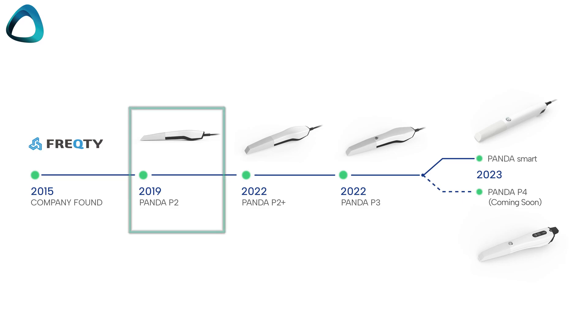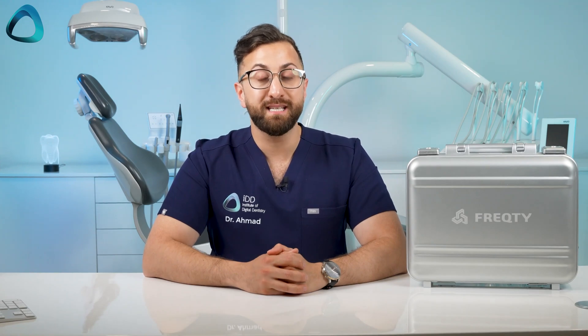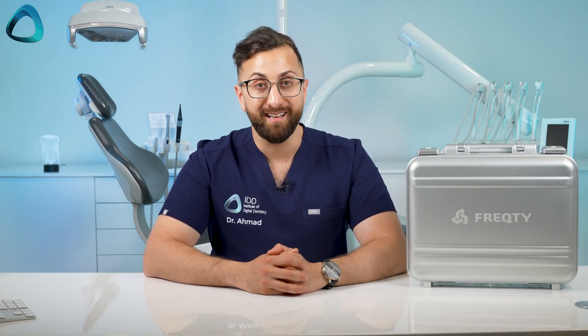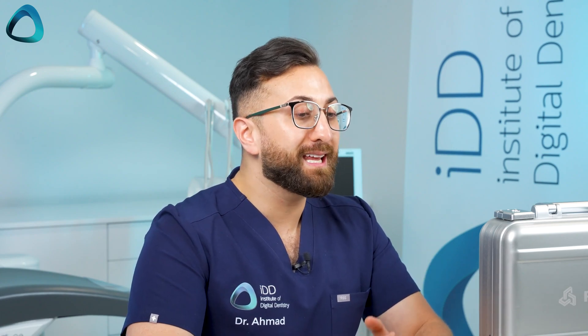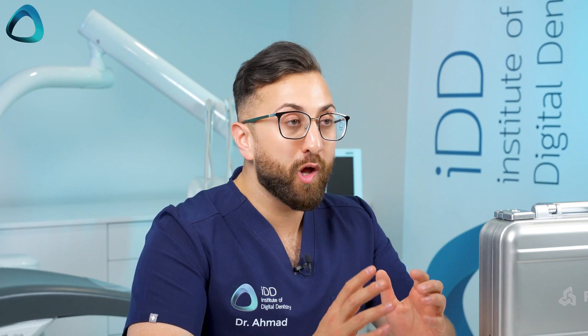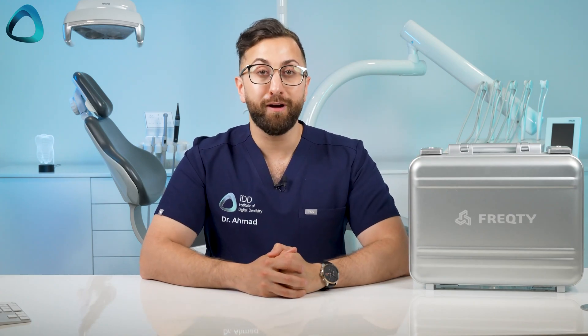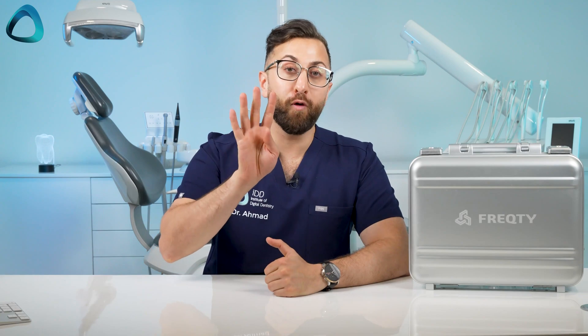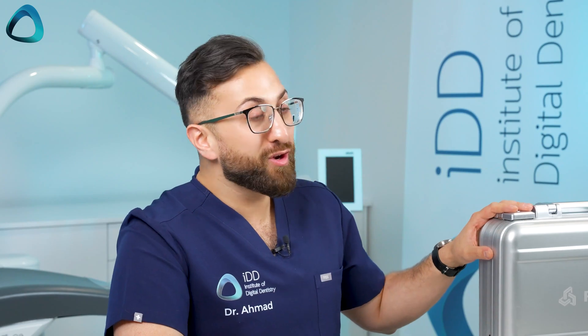In 2019, they released their first scanner, the Panda P2, and then three years later they released the Panda P3, its predecessor. I was actually involved in providing the company some feedback about that scanner, because although it was OK, the P3 felt like in the current market a lot of things could be improved. And finally we have the Panda Smart — the latest and greatest from Freqty Technology and the fourth generation Panda scanner. So that's enough talk. Let's see what you get with the scanner.